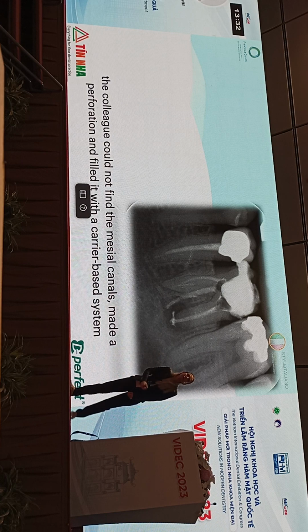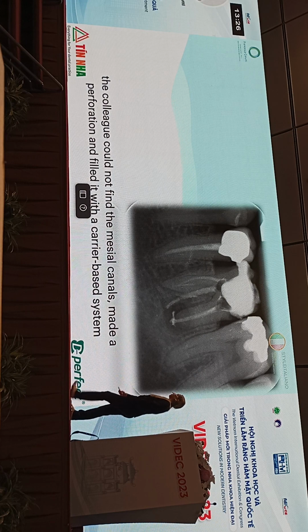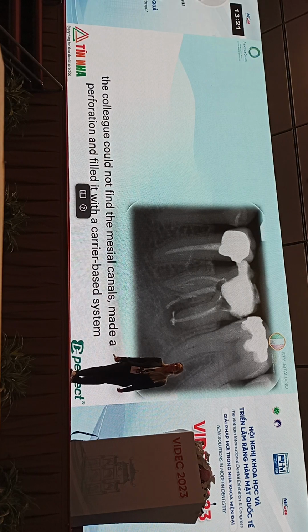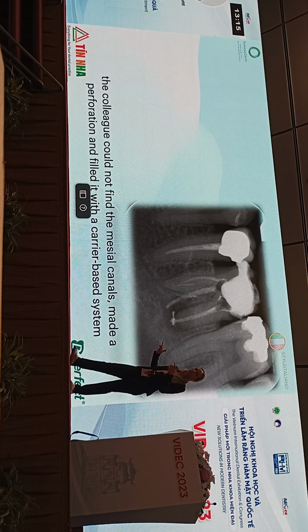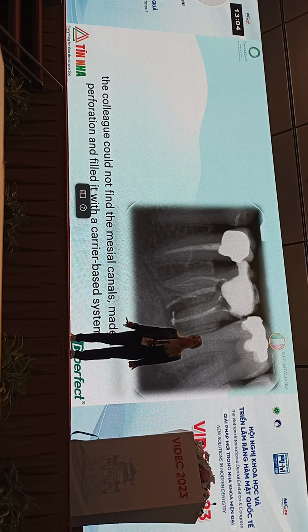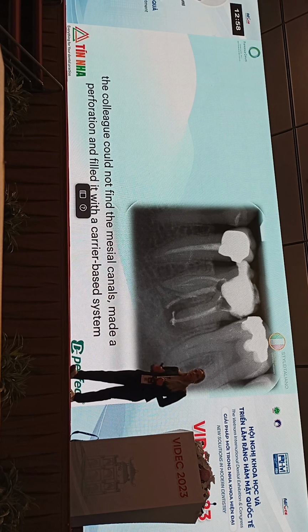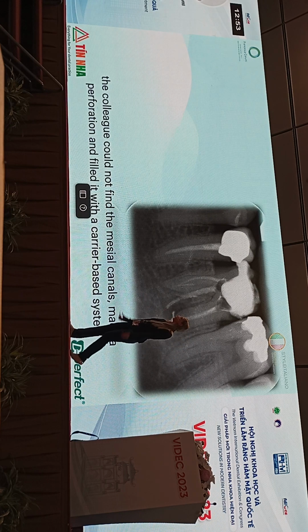This is another problem. Perforations, often due to a wrong access cavity. So, a colleague tried to retreat this tooth, and he didn't find the canals. At a certain point, he found something that was bleeding. So he tried to clean and fill it with a thermofill. The patient was crazy in pain. So my colleague said, "Okay, I'm extracting the tooth." And the patient said, "No, I'm 40. I want my tooth. I don't want an implant." And I agree with the patient. So he sends the patient to me to try to recover his tooth.